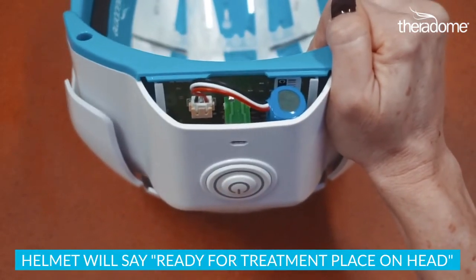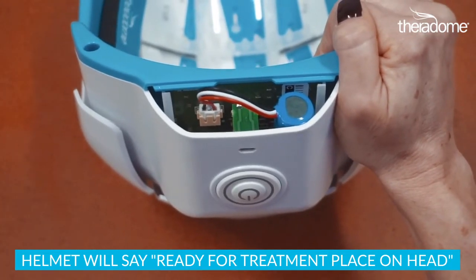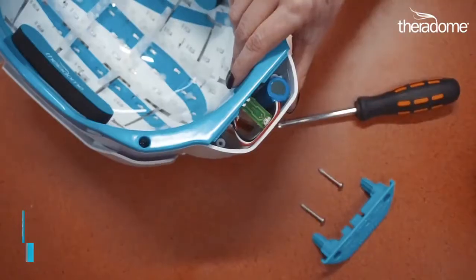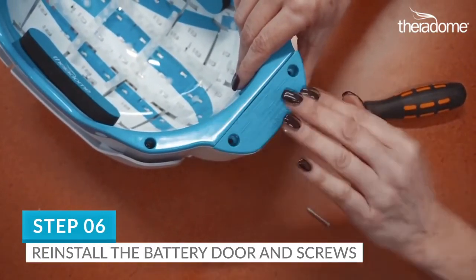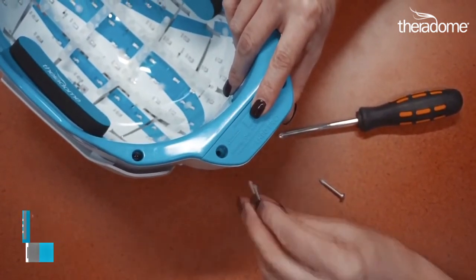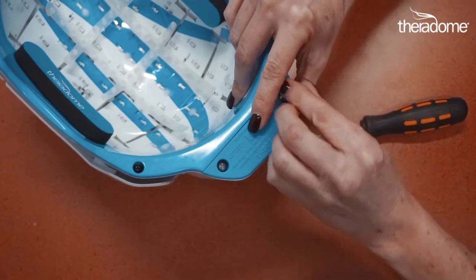The helmet will then say "Ready for treatment. Place on head." Step 6. Now reinstall the battery door. Don't turn the helmet on until the battery door is shut and the two Phillips screws are reinstalled. Great job.